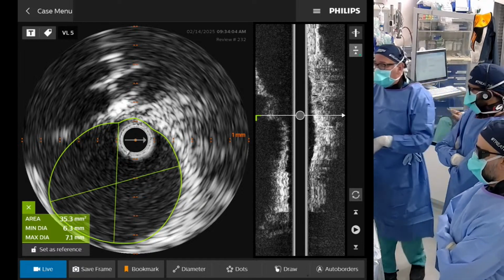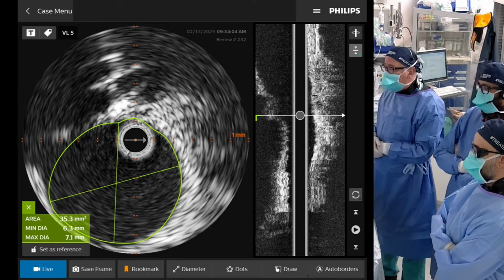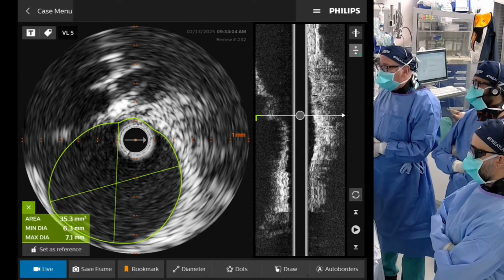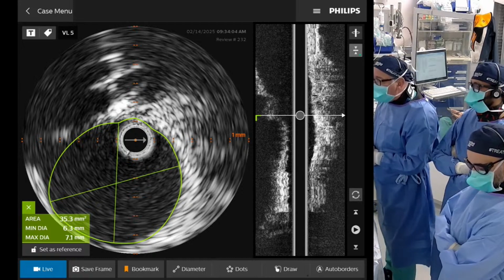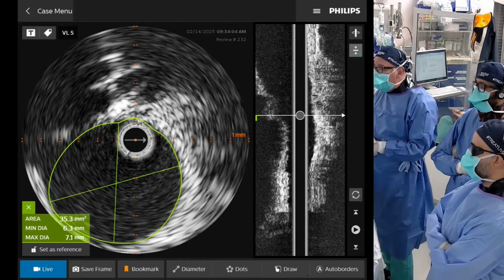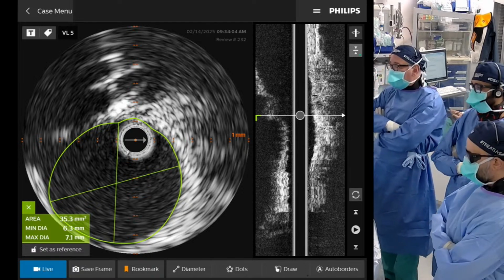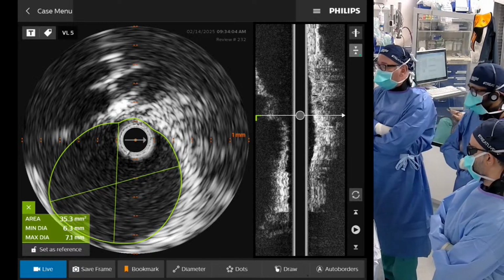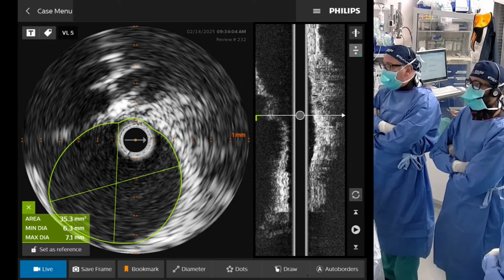So again, I'll ask you, Aaron, and you, Parag, what do you think we should put in? Should we put in a 6.0 bear? Should we put in a 7.0 bear? Obviously, there's no such thing as a 6.0 or a 7.0 drug-eluting. We could be very conservative and put in a 5.0 drug-eluting. I also agree with Parag. I don't really like the idea of putting covered stents in the renal arteries yet, especially because it's a 035 platform, and I get concerned about spasm with that.